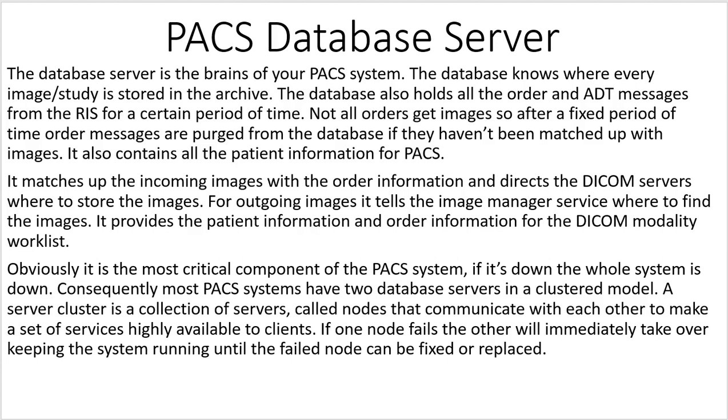It matches up the incoming images with the order information and directs the DICOM servers where to store the images. For outgoing images, it tells the image manager service where to find the images, and it provides the patient information and order information for the DICOM modality worklist. Obviously, this is the most critical component of the PACS system. If it's down, the whole system is down.